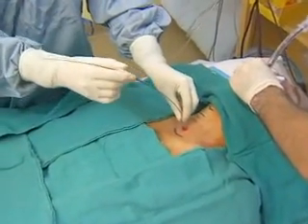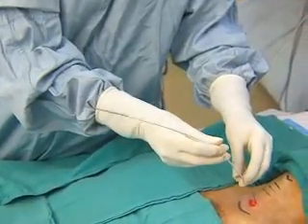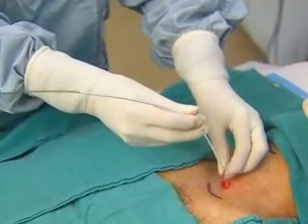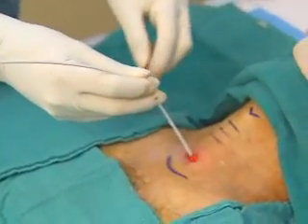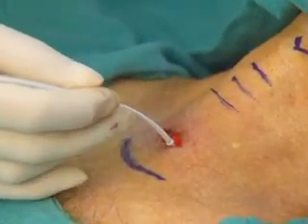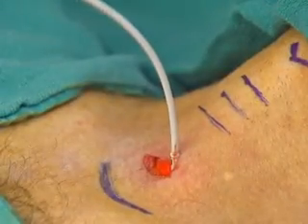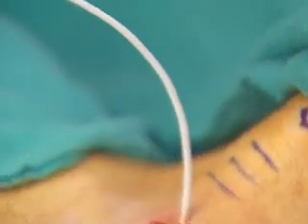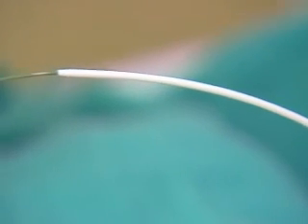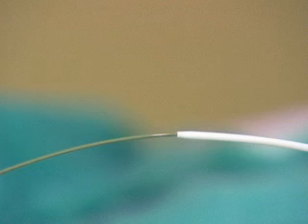The dilator is removed and replaced by the 8 French guiding catheter, which is advanced to the skin level mark on the wire guide. The guiding catheter and wire guide are inserted as a unit into the trachea until the safety ridge on the guiding catheter is at the skin level. Proper positioning of the guiding catheter can be constantly confirmed by aligning the proximal end of the catheter with the proximal mark on the wire guide. This will prevent displacement of the J-wire and possible trauma to the posterior tracheal wall during subsequent manipulations.